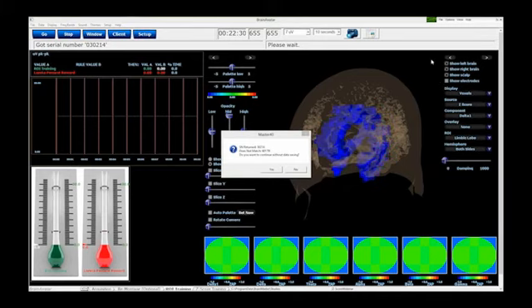Yes, the network hub training is absolute power training. They are basically taking the overall absolute power of that location. It is not a connectivity measurement.